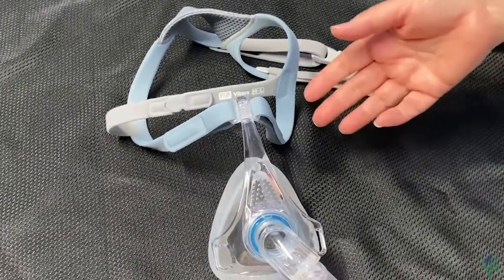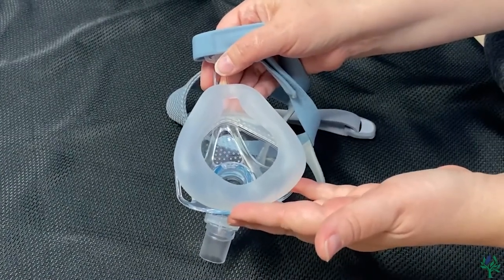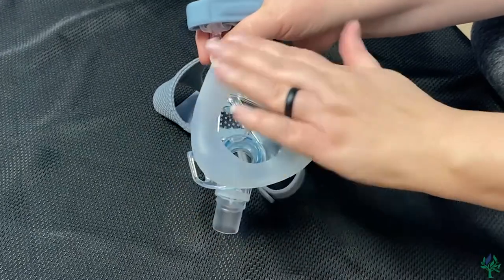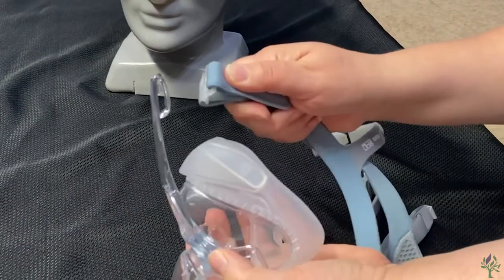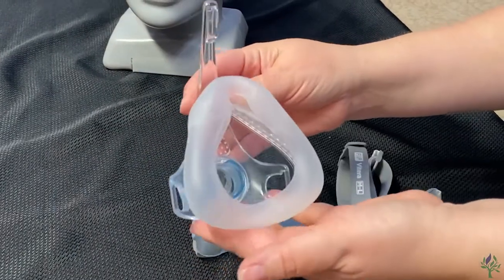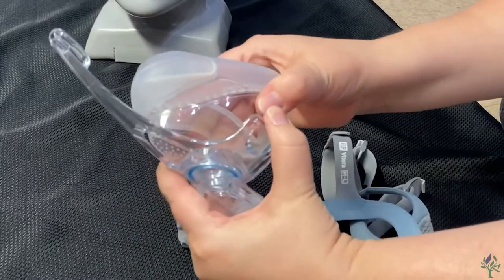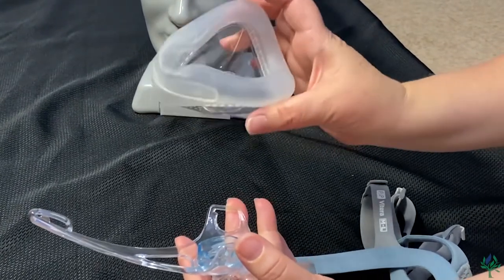The next thing that we're going to talk about is how you're going to want to clean this mask. Each day, you're going to want to clean this cushion here just to get those natural facial oils off. You can use a warm soapy cloth, a baby wipe, or a CPAP wipe — anything that doesn't contain alcohol is just fine. You can either wipe it here, or you can grab the headgear, push up, and that will remove that entire piece from the headgear. To remove the cushion, grab on either side and squeeze that cushion together and pull, and it will snap out for ease of cleaning and also for replacing that cushion.